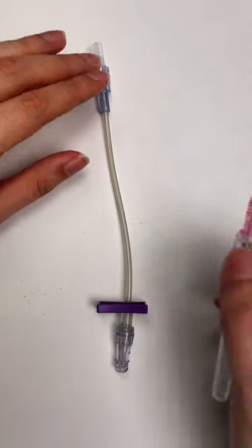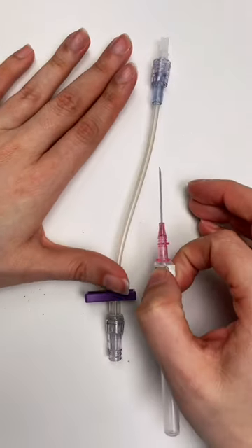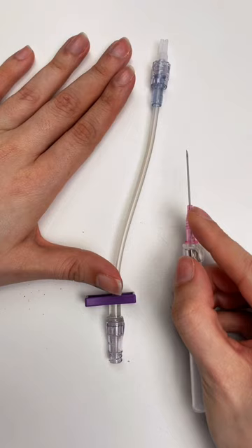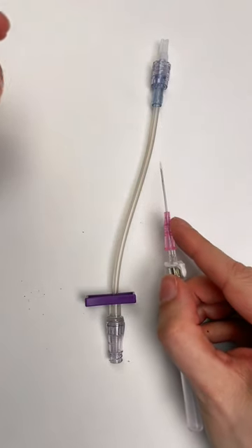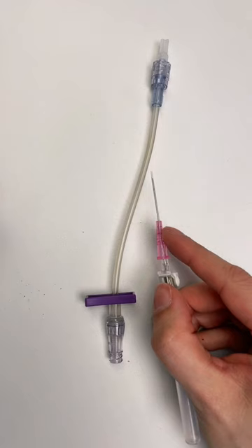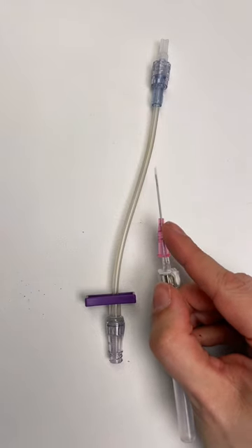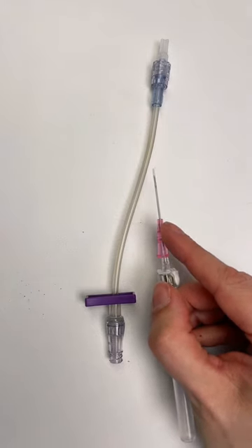If you have ever gotten perfect IV flash and gone to advance your catheter in the vein only to have it not advance or to blow the vein entirely, let me show you what's going on and how you can help to avoid it.